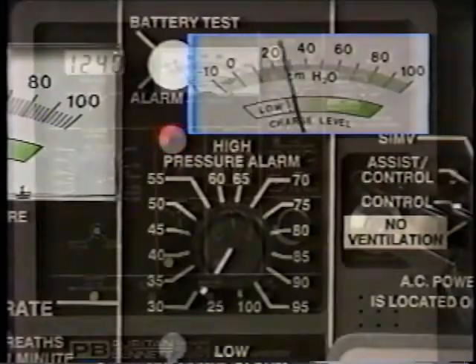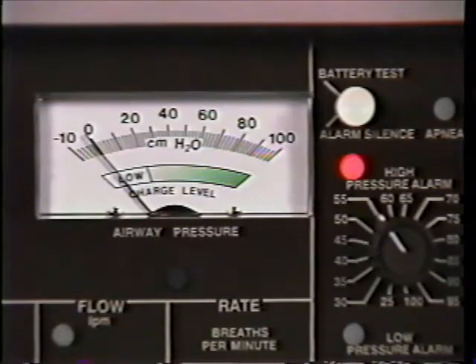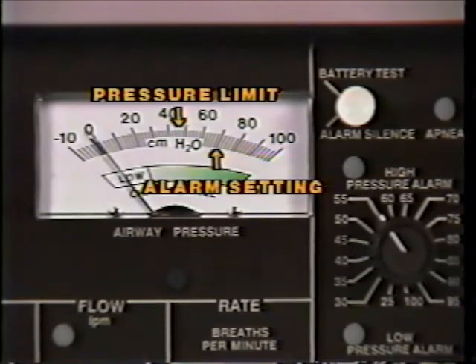If airway pressure reaches the alarm setting, an alarm sounds and the high pressure indicator will light and airway pressure will be automatically vented at the patient exhalation valve. When the alarm condition is no longer active, this indicator is latched on until manually reset by the alarm silence button. Setting the high pressure alarm above the pressure limit control setting will not allow the high pressure alarm to sound. This should only be done when prescribed and when the patient is continuously monitored by a trained attendant.